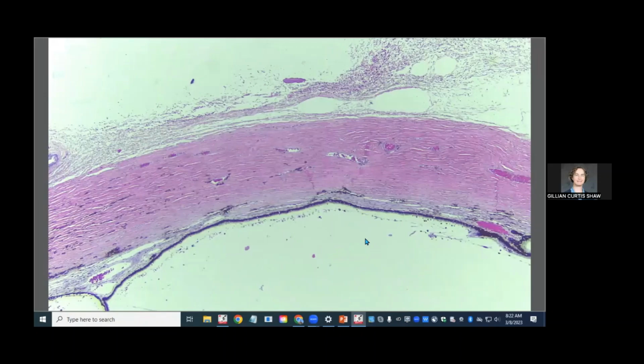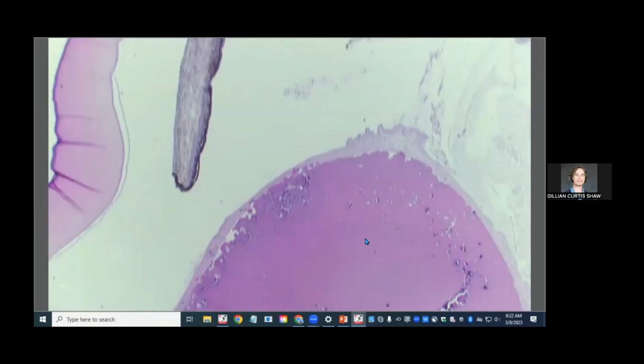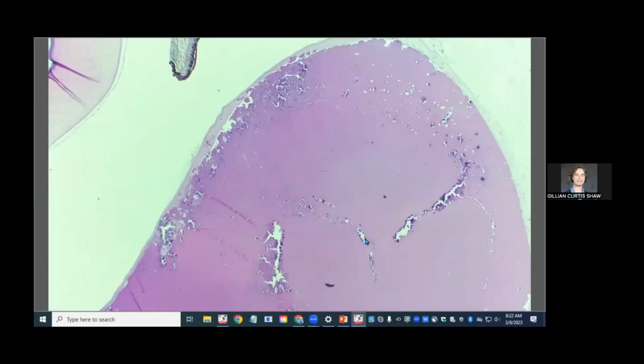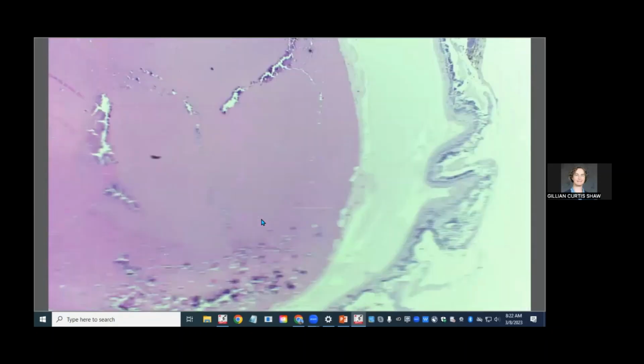So this is many of the different lesions of something like anterior segment dysgenesis. This is one of the flavors of anterior segment dysgenesis. We've got lens capsule wrinkling here and a bunch of cortical lens fiber degeneration and mineralization. So we've got a good cataract that happens to look like an edible treat from Brazil. And then here's our retina.